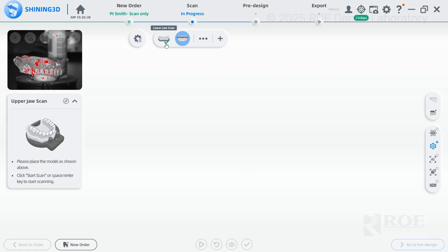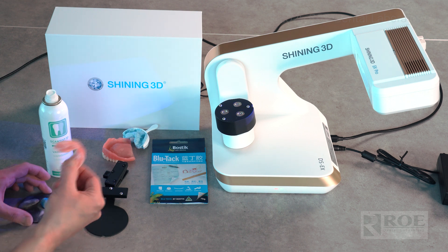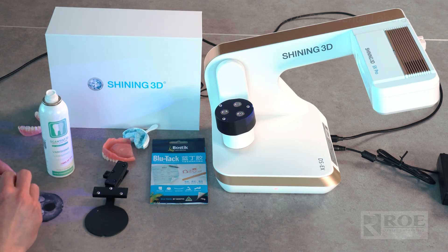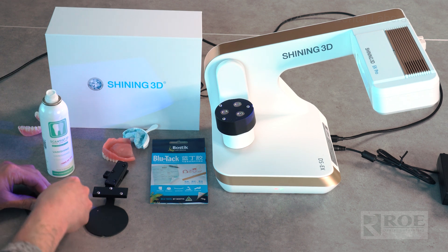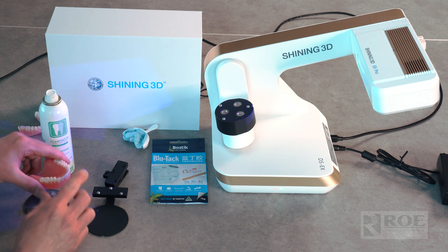The lower now has a checkmark — the lower has been scanned. Now we're moving to the upper jaw. Remove the plate and the lower denture. Get your blue tack — make that little cube again to keep the denture off the plate so you can cut the plate out as needed. Occlusal side first.